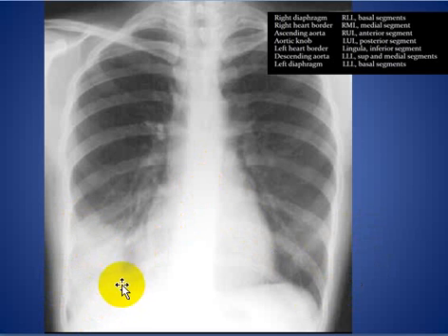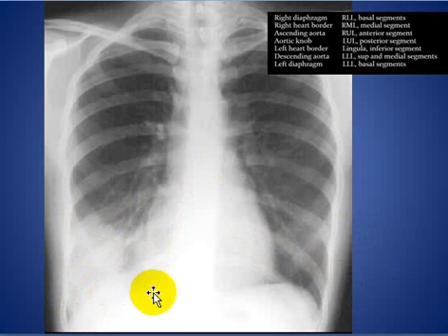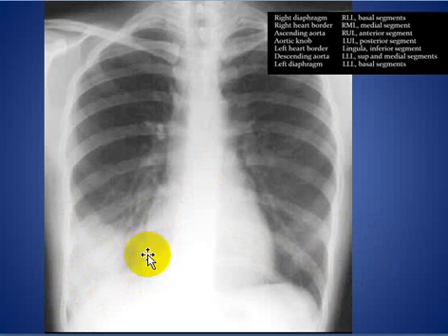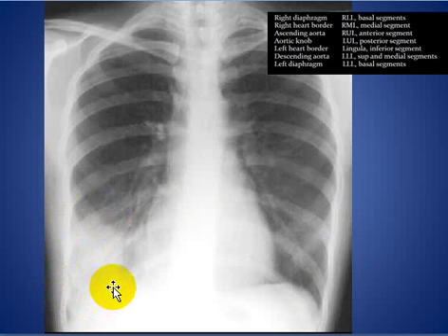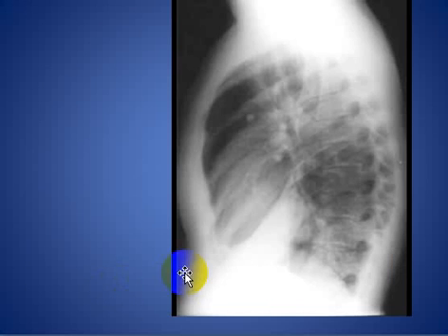In another example, you see an opacity obliterating the right hemidiaphragm, while the right cardiac border is not obliterated and is well seen. Therefore, that opacity is located in the right lower lobe basal segments, as confirmed on the lateral chest X-ray.